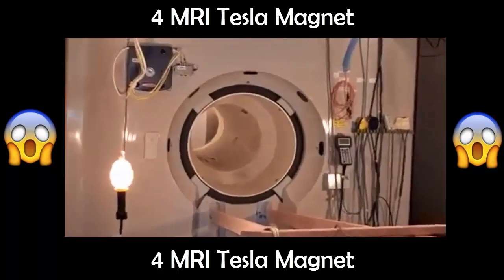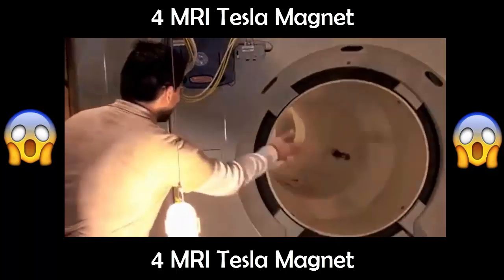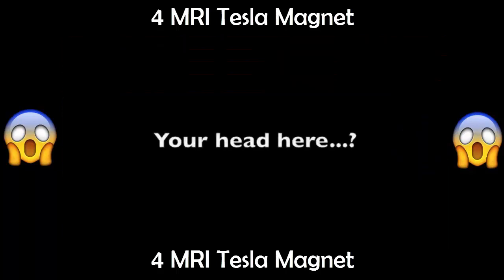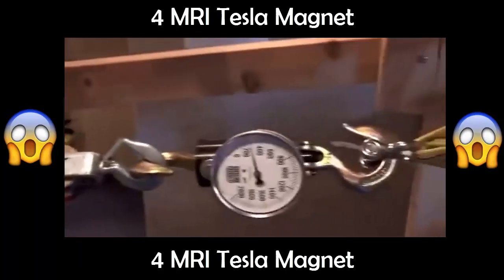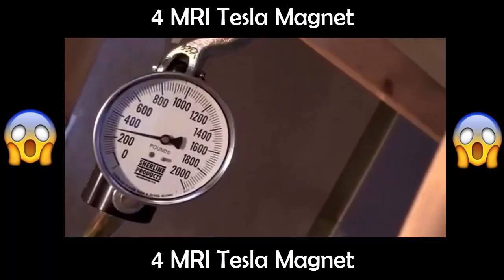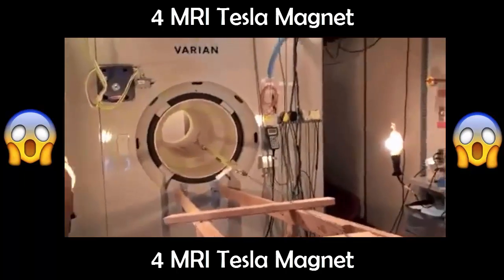Whoo! Hey! Did you see this? Whoa! So the force we're reading on that guy right now, just at that part of the magnet, is close to 300 — 280? Yep, pretty good. Let's see what we can get.